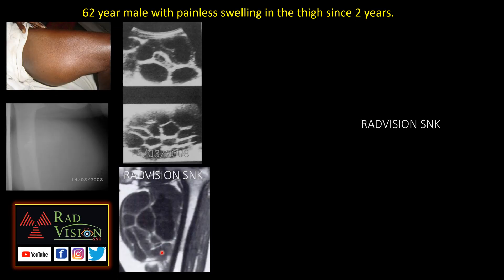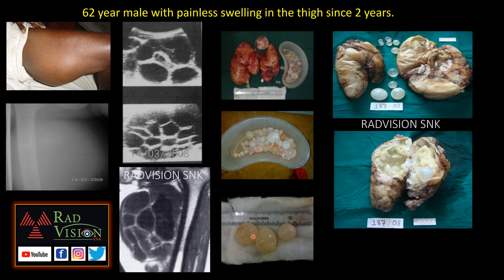Next case: a 62-year-old male with painless swelling in the thigh for 2 years. You can see there is a large cystic lesion in the thigh, also showing a large homogenous radiopaque density lesion on plain film. On ultrasound, there is a cystic lesion with multiple daughter cysts. On MRI, there are large cystic lesions with daughter cysts and enhancing septa. The intraoperative findings confirm the large cystic lesion with multiple daughter cysts, and the gross specimen is shown. This is hydatidosis of the thigh.